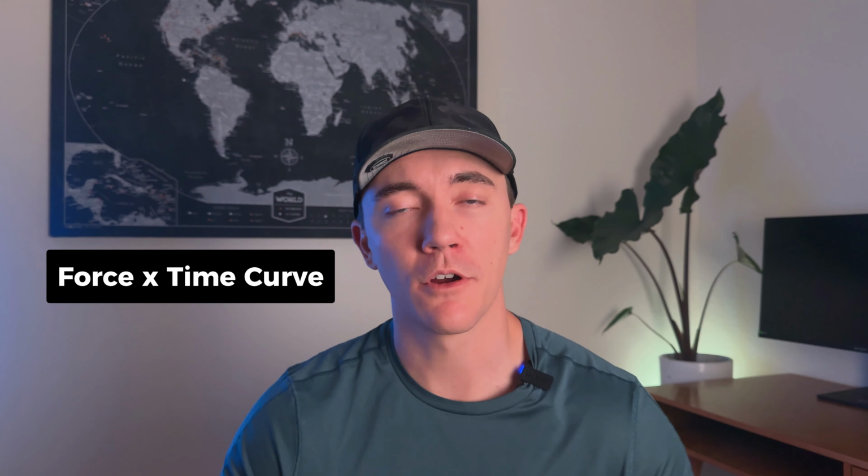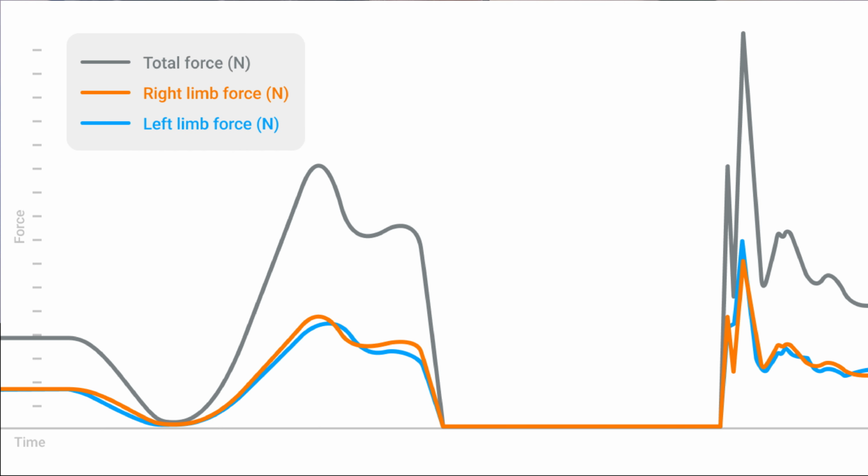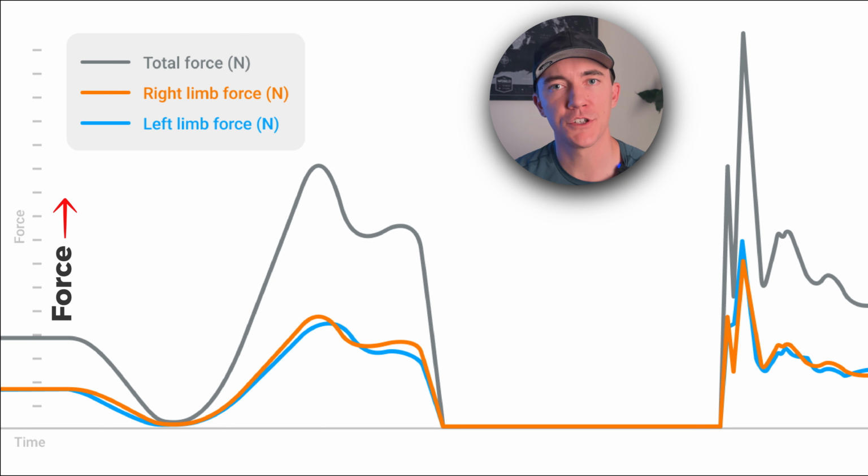In this video, I'm gonna take you step by step on how to understand the basics of a counter movement jump, which is the most common jump that you'll do on force plates, and how it presents on the force time curve so you understand how to interpret it. Let's dive in.